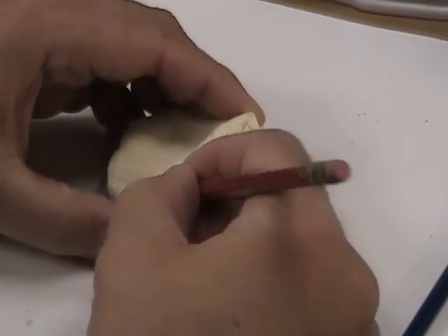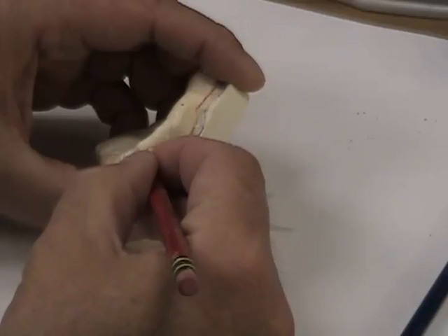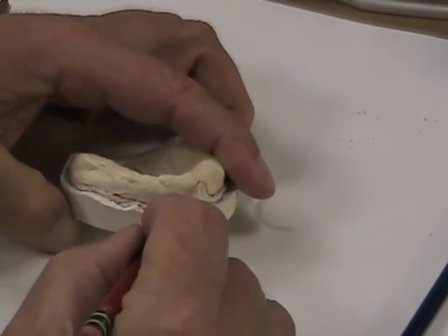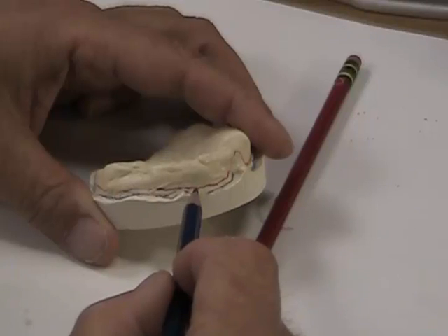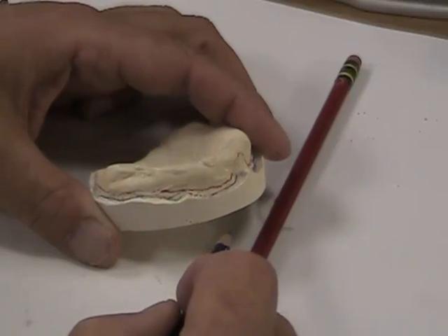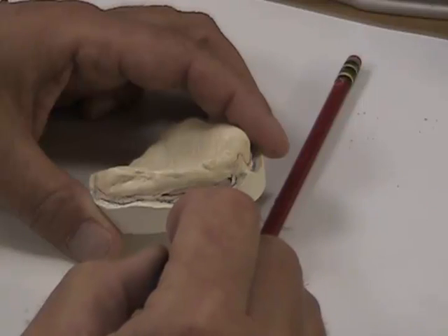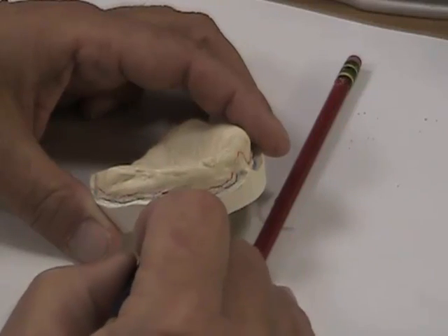On this impression, you can see we want to be short of the vestibular area when we're making our custom trays. The reason is because the area that we've relieved or taken back off of the floor is where the actual border molding material is going to go. Custom trays are made from overextended impressions, which are preliminary, and then are cut back. If we know where the bottom of the vestibular area is, we can relieve back about an eighth of an inch, so we can get that area molded clinically.